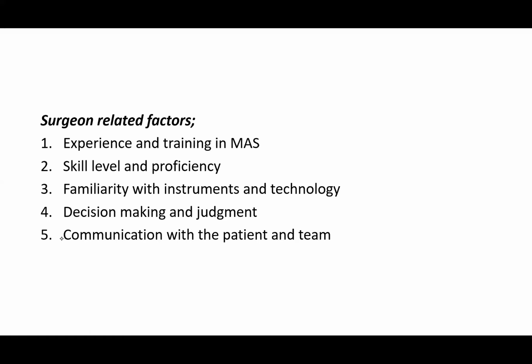So if you are not involved in all the basic training, laparoscopic suturing, all those knot tying, and you go for a more advanced training where the proctors might not have time, because all those trainings are short, nobody will have time to start using an endo trainer to teach you. So this is something that you must be involved in before going for any training that will involve live patients. Okay.